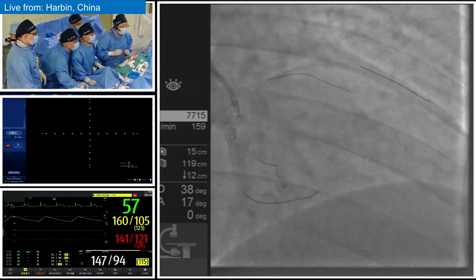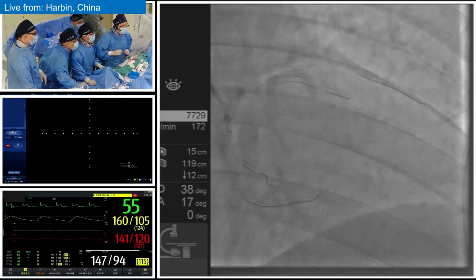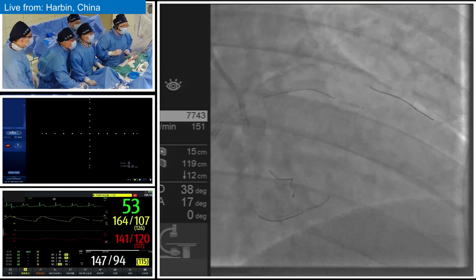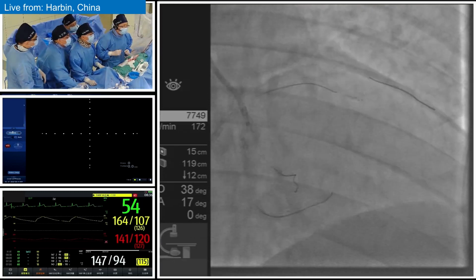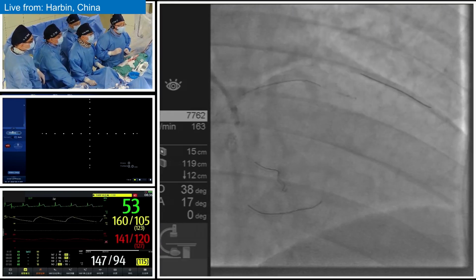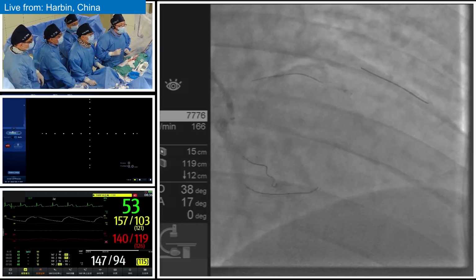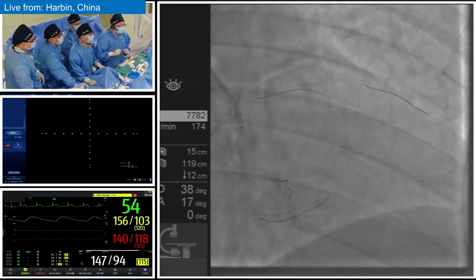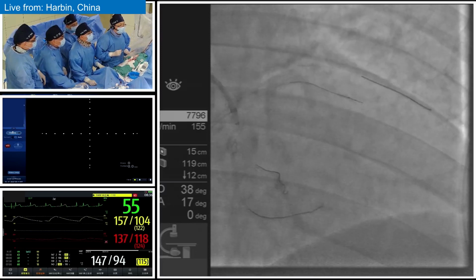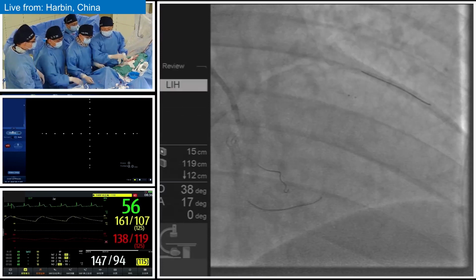So like the Professor introduced, this is a stick and swap technique. This Pilot 200 is, I think, one of the most popular wires for the ADR techniques. Its crossing capability is relatively strong, strong enough. And second, this polymer is favorable for ADR puncture, increasing the capability of re-entry into the distal true lumen without causing a very big hematoma and damage to the subintimal space.